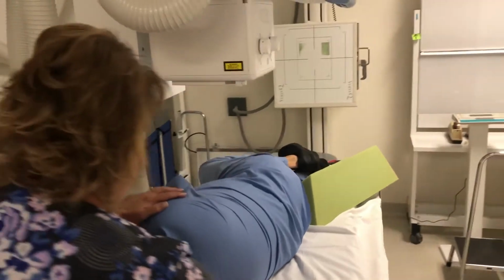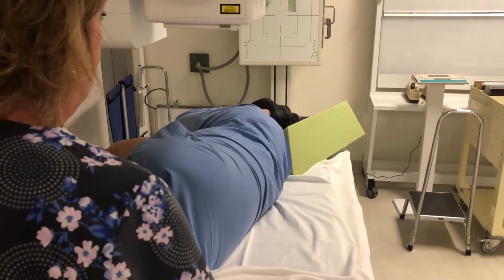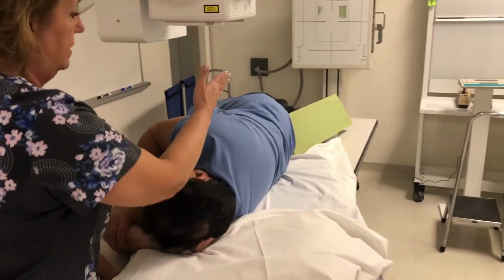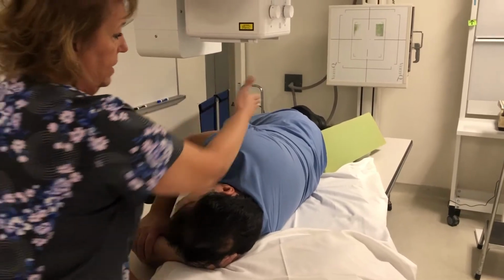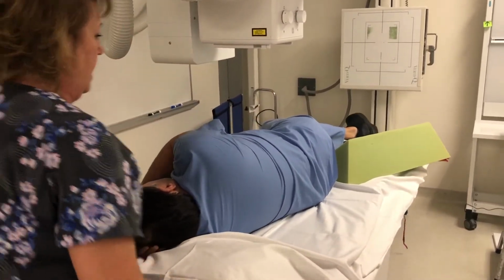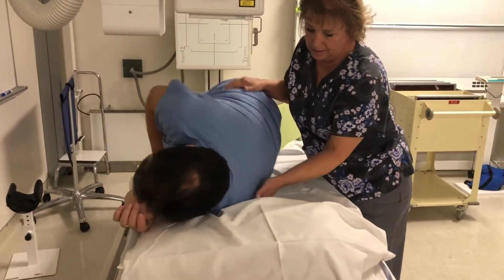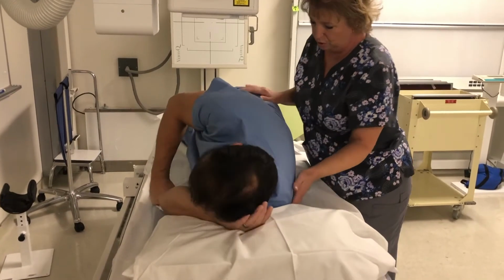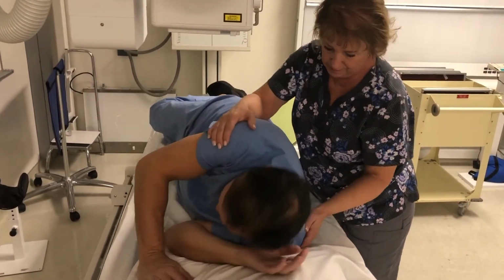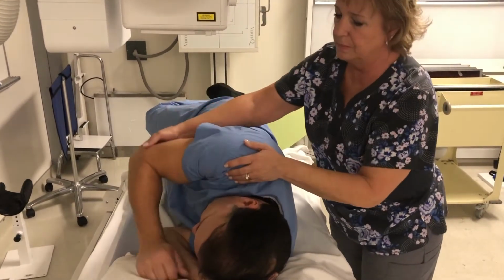Now if you had a patient that was not moving very well, what I can do to accomplish that is just twist the pad until his shoulders and his hips were going down the midline of the table. He's pretty mobile, so I'm going to have you bring your left shoulder back toward me. A little bit more with your shoulder, not your hips. A little bit back with your shoulder. Thank you. Okay, so now his shoulders, you can bring here.